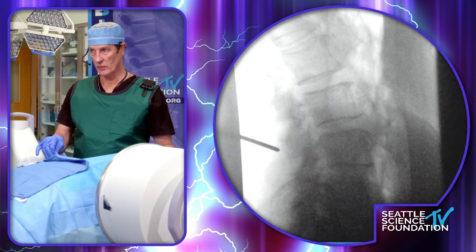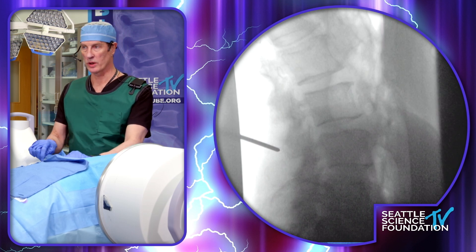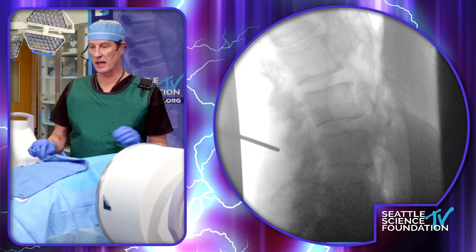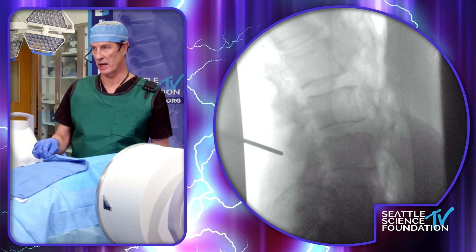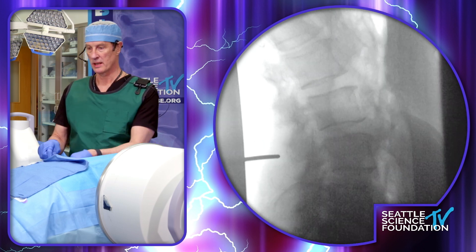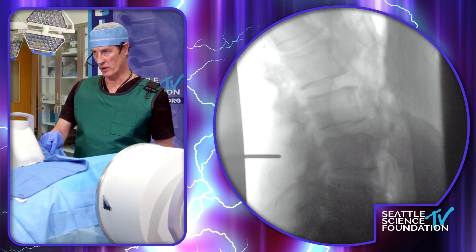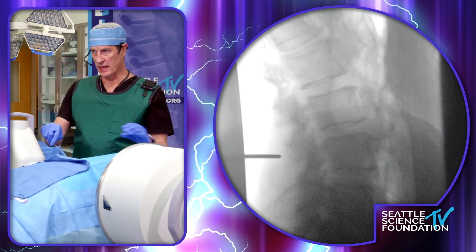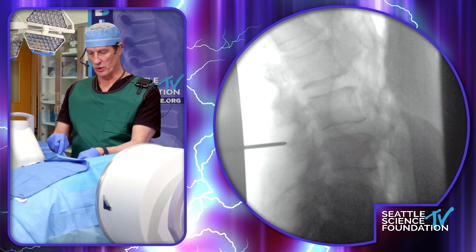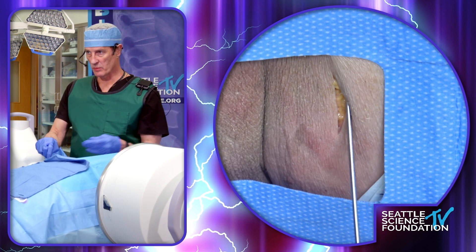Go ahead and shoot it again. So, we're going to come back around. A lot of times we just want to see the spinous processes. I'm going to go a little bit farther — inferior and just posterior to the inferior articular process. I'm going to go down, and right about there.